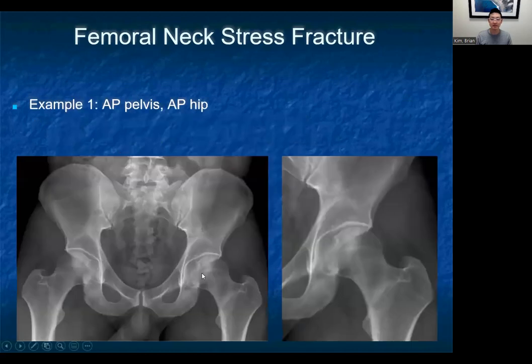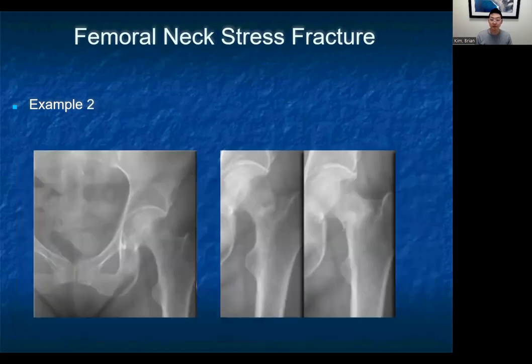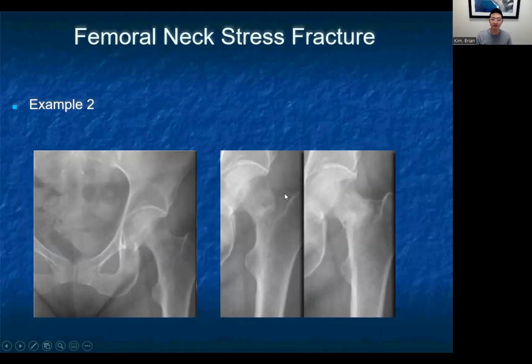Here we have an AP of the pelvis and, zoomed in, an AP of the left hip. You may not see any abnormalities initially, but if you look closely at the base of the femoral neck, there's a linear sclerotic line. There's no lucency indicating an actual fracture line, but there's a subtle abnormality that warrants further investigation, especially in the context of anterior hip, leg, or thigh pain. In another example, this patient had a normal x-ray initially, but one month later there was a clear fracture line — progression due to ongoing weight-bearing activity — and the fracture line persisted at three months, though with some evidence of healing.